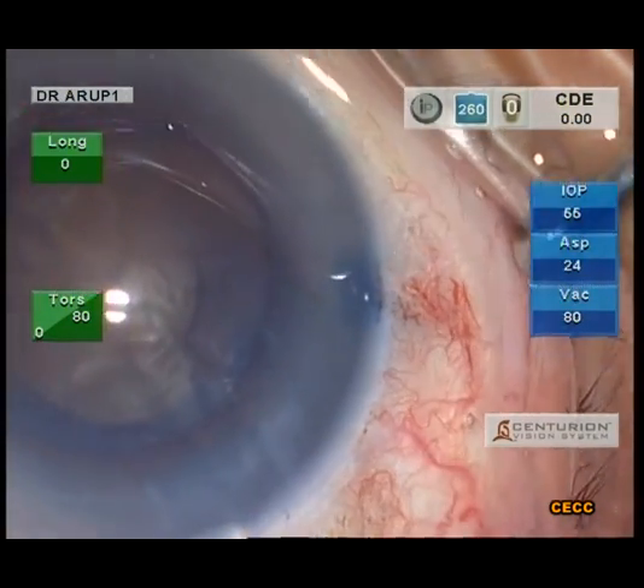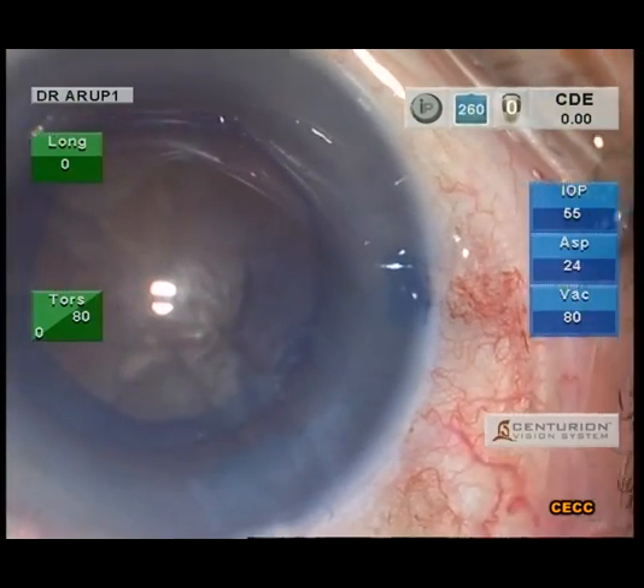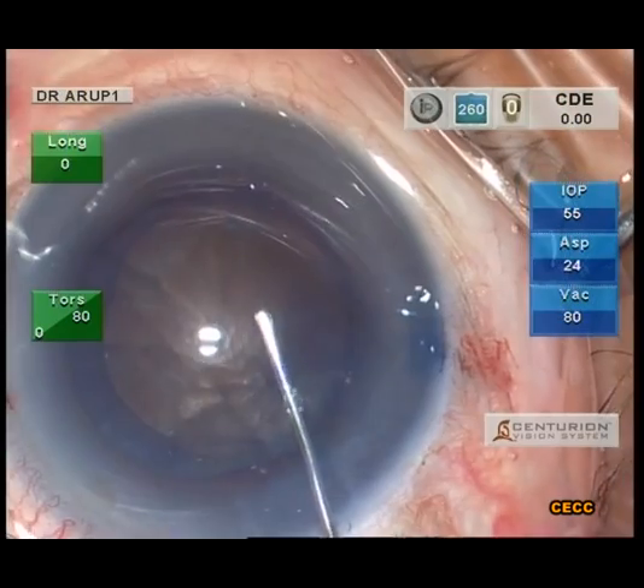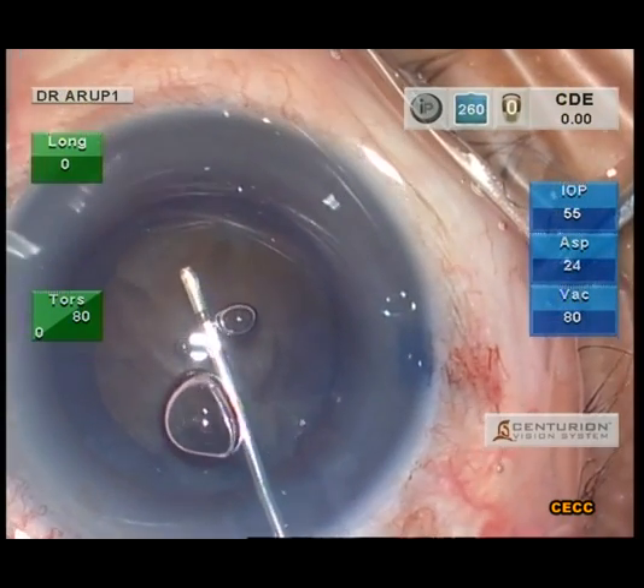A little bit of OVD is burped out of the wound before initiating the hydrostep. The anterior chamber is then topped up once again with a dispersive OVD.